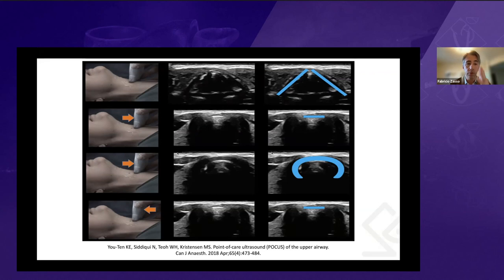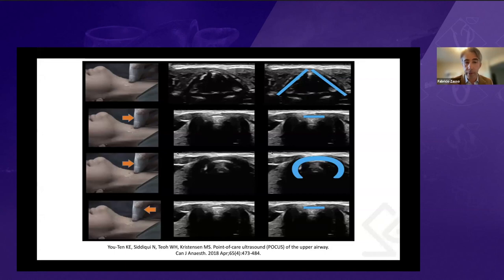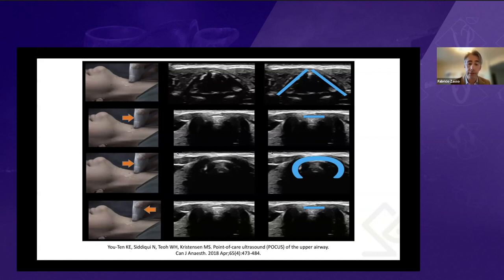There are two approaches for identifying the cricothyroid membrane by ultrasound: the transverse and the longitudinal approach. The transverse is also called TACA, which stands for Thyroid-Air-Cricoid-Air. In the TACA technique, on the upper image you can see the thyroid cartilage in an inverted-V shape. As you scroll down with the probe, you'll see a small bright white line — the air interface at the cricothyroid membrane. Moving further down, you see the cricoid cartilage in a C-shape. You then go back up to locate the cricothyroid membrane at the correct level.